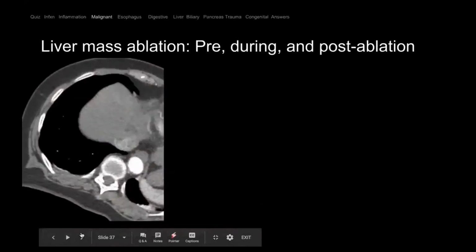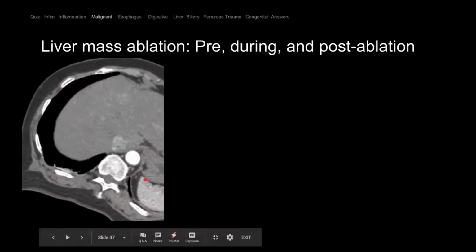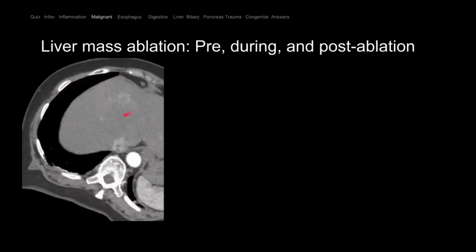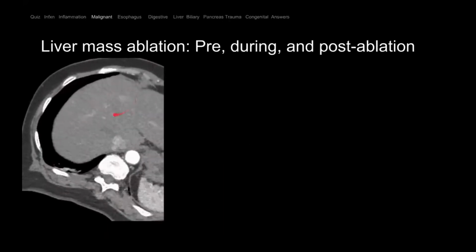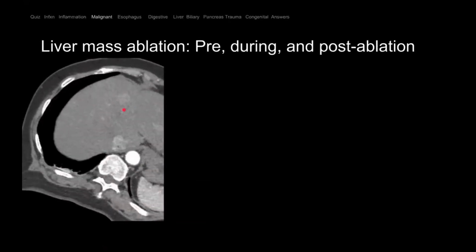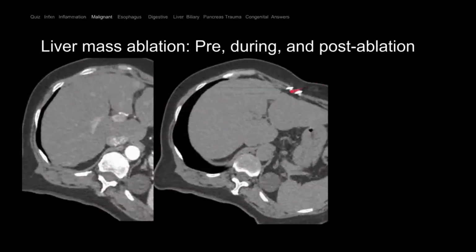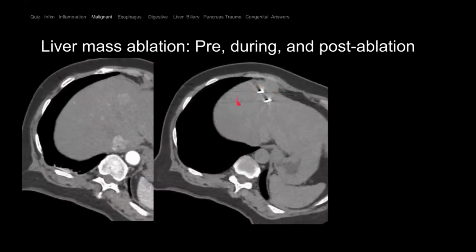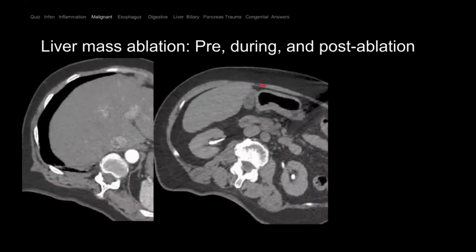And that's reserved for larger tumors. Patients who have smaller tumors, like we see here, there's this little focus here. It's smaller, as you can see, compared to the other tumor that we saw. They can get an ablation. So in an ablation, you see this needle here, it's going in, and at the tip, it burns. So you basically burn the tumor.